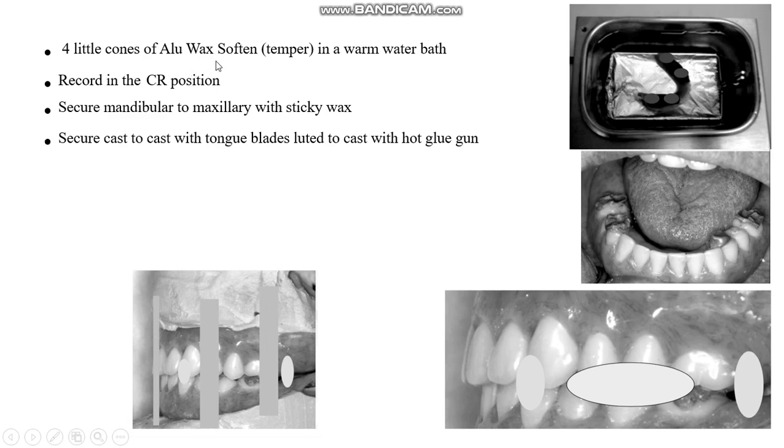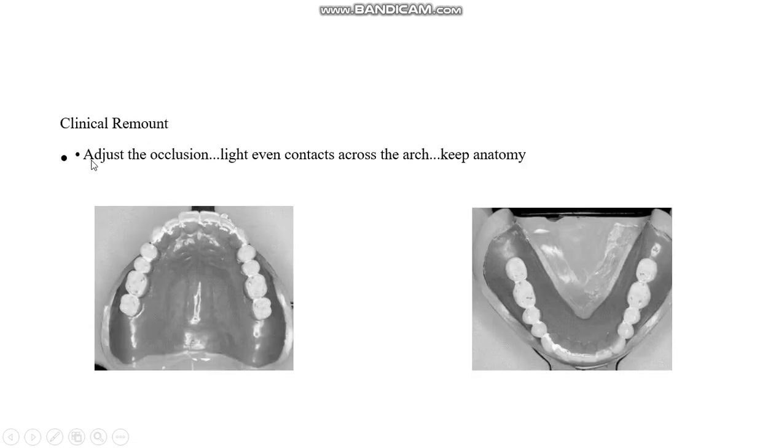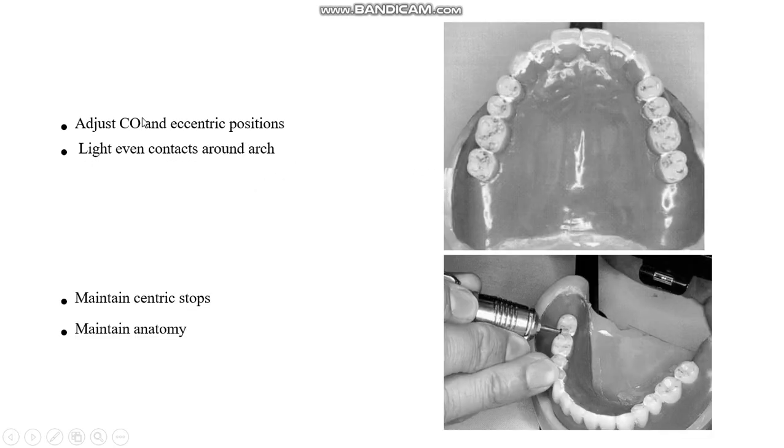Four little cones of wax softened in a water bath, record in centric relation position, secure mandibular to maxillary with sticky wax, like this. Secure cast to cast with tongue blades, glue to the cast with hot glue gun. Adjust the occlusion, even contact across the arch, keep anatomy. Adjust centric occlusion and eccentric position, even contact around the arch. Maintain centric stops, maintain anatomy.